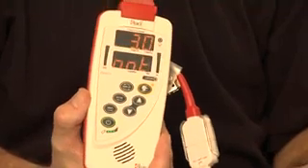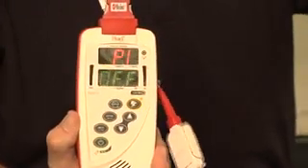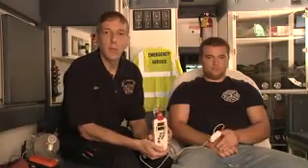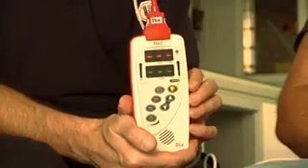One of the tools in the new EMS educational standards at all levels of practice is a pulse oximeter. And because we no longer administer oxygen to patients who are saturating at levels above 94%, a pulse oximeter gives us an early warning that a patient is deteriorating. So we'll place a pulse oximeter on the patient's finger, and we'll pay attention to the saturation continuously during care to observe for a drop below 94%. If it drops below 94%, we either have a problem with oxygenation or perhaps a problem with ventilation.